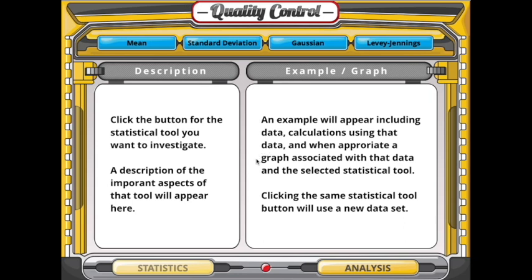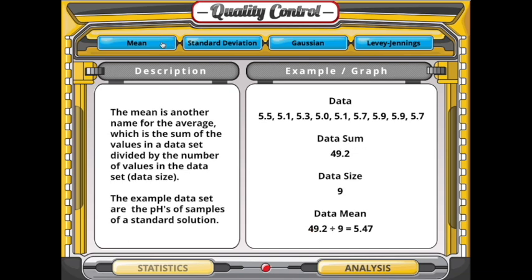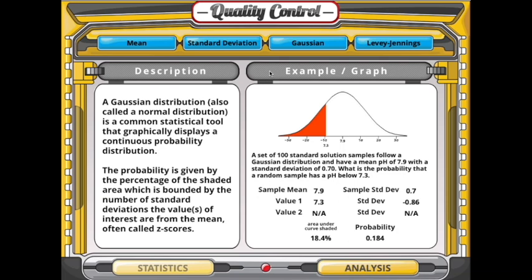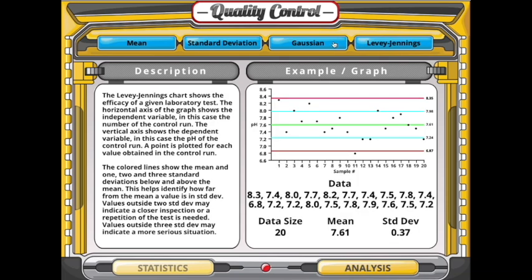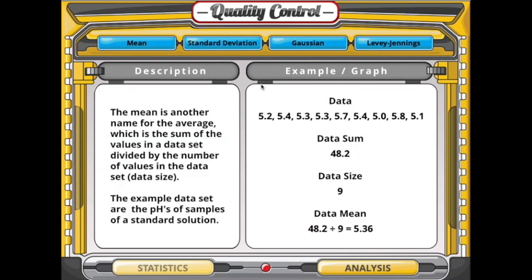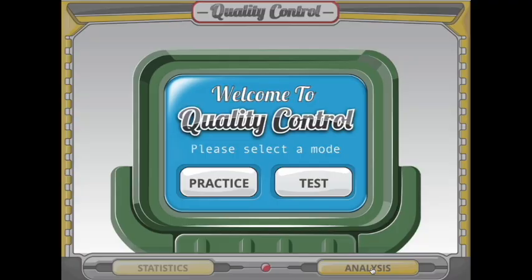Selecting the various blue buttons at the top of the screen provides information on completing some statistical tests, including the mean and standard deviation. Two important graphical tools are also presented by selecting the blue buttons. When you've finished reviewing the statistical portion of the simulation, select the Analysis button at the bottom of the screen to continue. Start by selecting the Practice button.